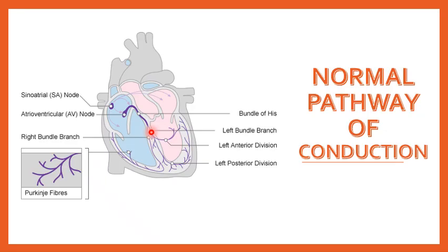In our upcoming video, we are going to have a little mini course in hemiblock. And when we use the term hemiblock, what we mean is that half or one fascicle of the left bundle is blocked. But for today's purposes, we're going to say that over on that left side there, when we have a left bundle branch block, we mean both fascicles.